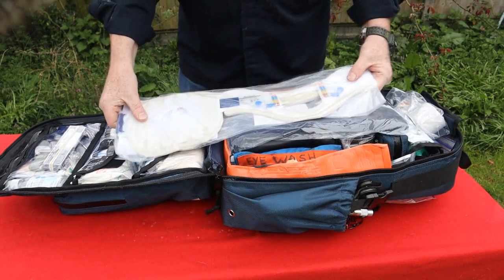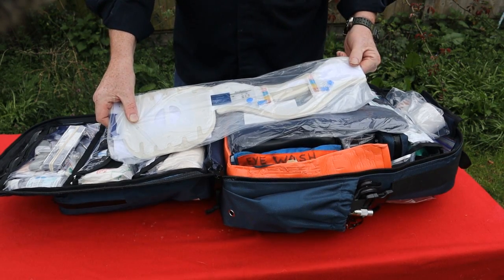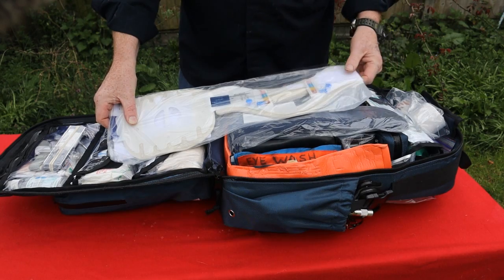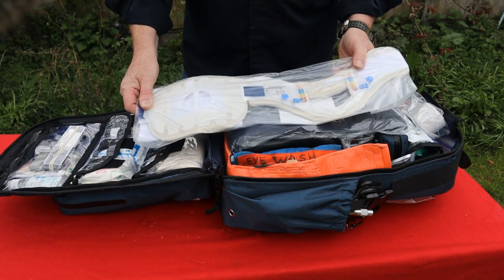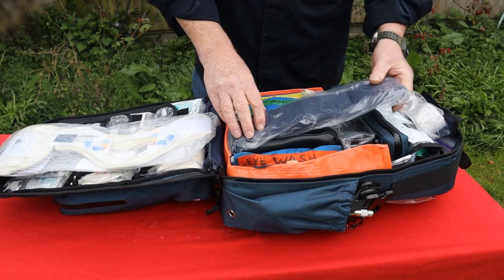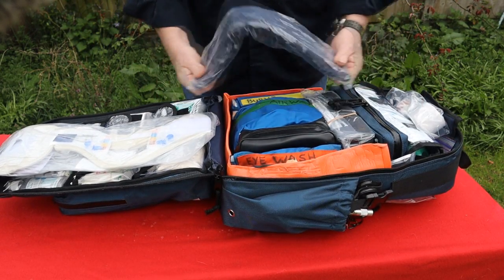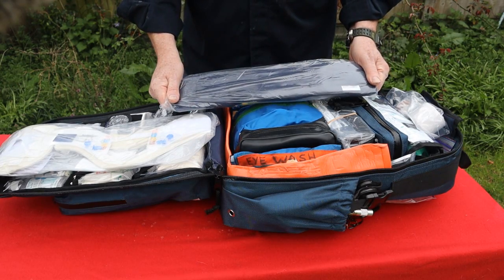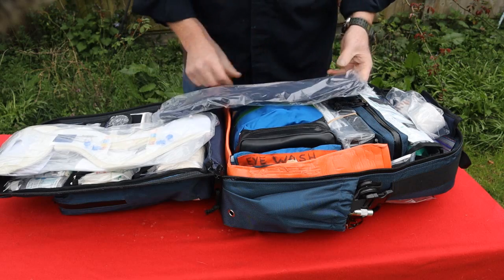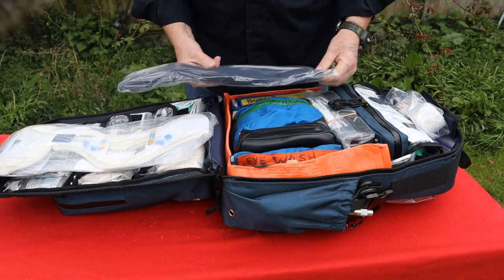Got one stiff neck collar in my kit. Adjustable, and it's short, medium, or short, regular, and what's called a no neck, but it's a stiff neck collar. So think road traffic accidents, fall from height, that sort of thing. I've got a soft collar here. Soft collars really, you'll find medical professionals that will tell you soft collars are absolutely pointless, and to a degree they are right.